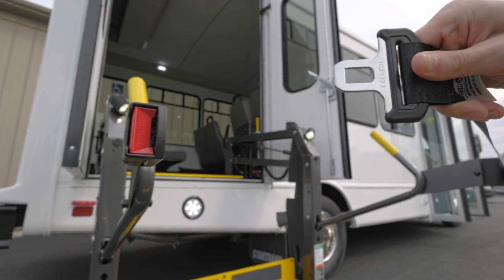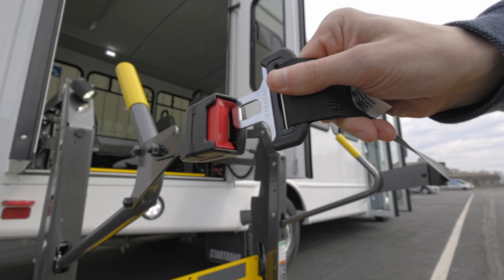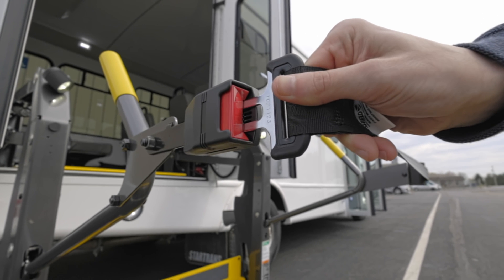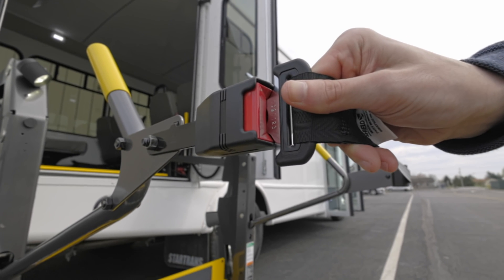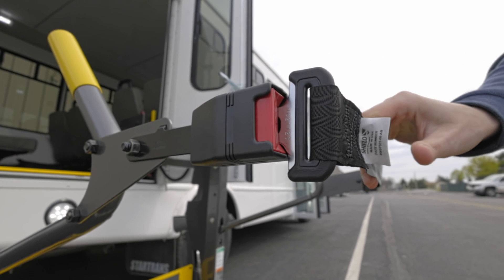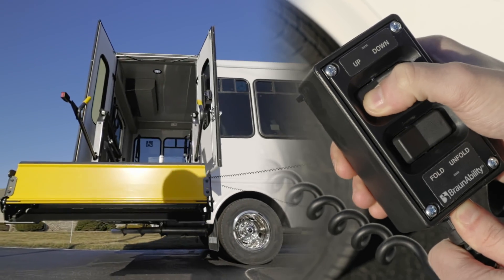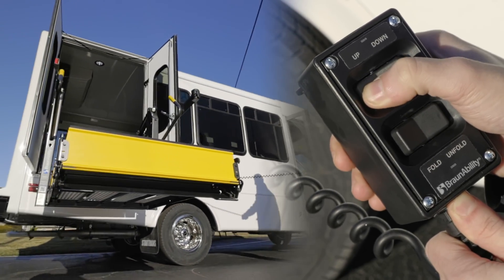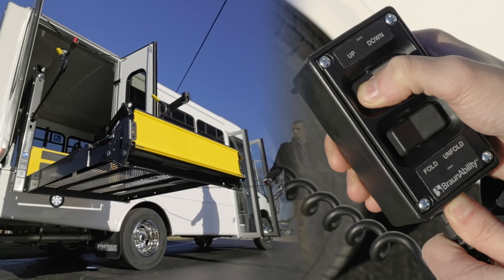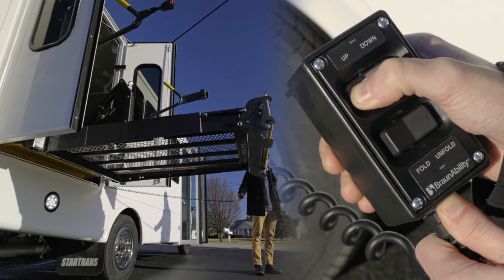When loading passengers or items onto the lift, make sure that everything is properly secured. A great way is by making use of the safety belt and buckle. Be sure to refer to manufacturer guidelines for more information. When you're ready to raise the lift, hold the up button to bring the platform back up until it stops and the back ramp comes down, allowing access into the vehicle.